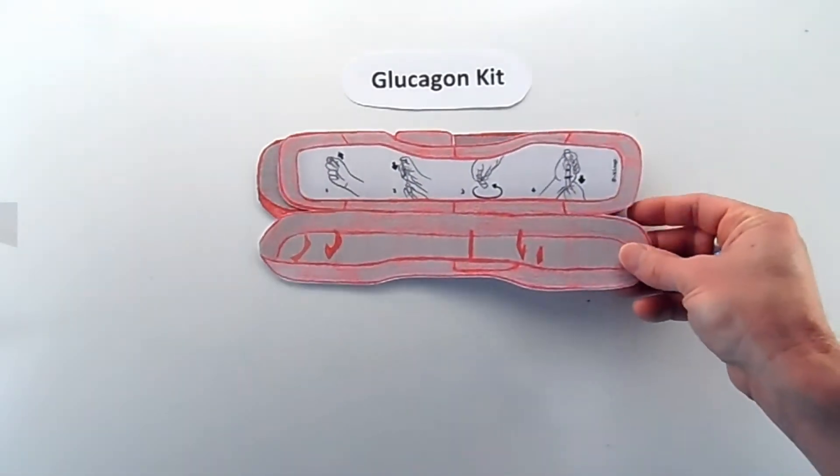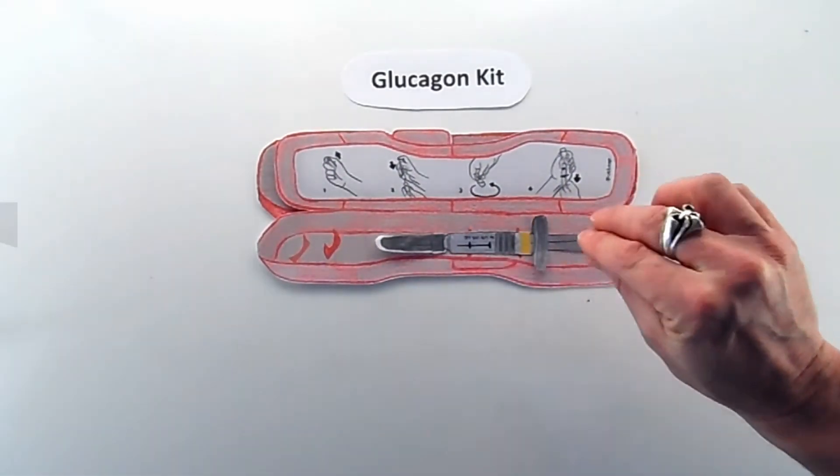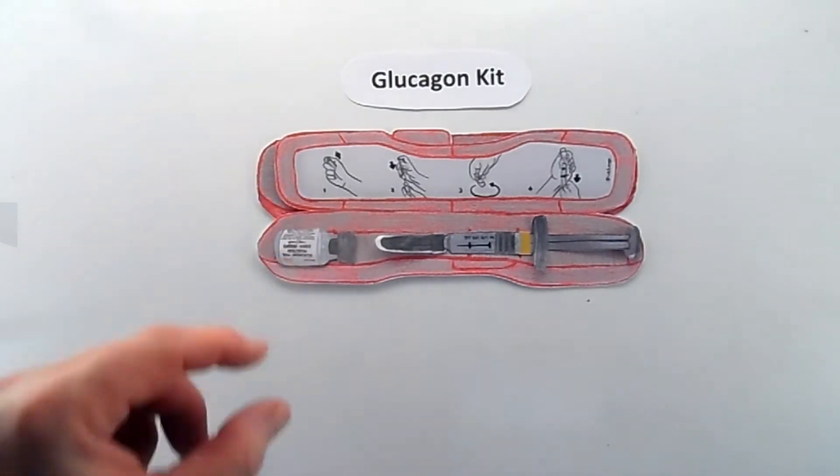Once you've got it, opening your glucagon kit, you will see a syringe filled with a clear liquid solution and a vial with a powder in it.